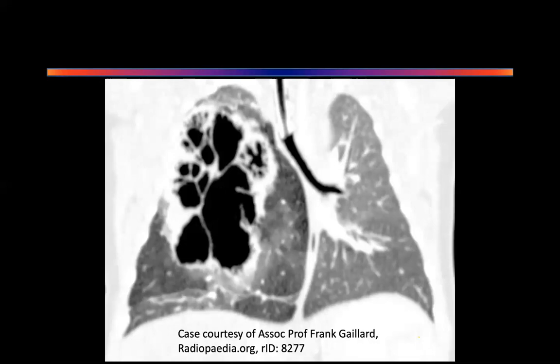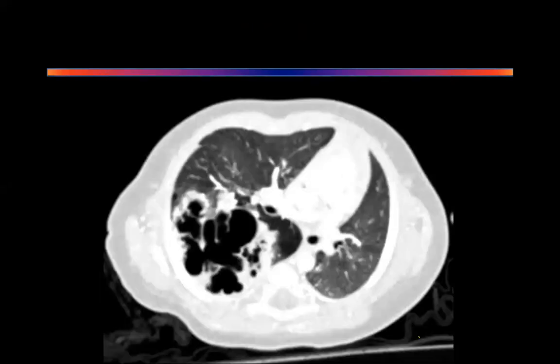Right. So this is a contrast CT scan. There are no descriptive markers on the CT scan, but it shows a multi-lobulated, septated lesion on the right side, causing mass effect and shift of the mediastinum to the left-hand side. Excellent. I'll show you another shot of this. Same CT scan, keep talking. It is a transverse section at the level of the heart, showing the lesion located in the posterior aspect of the right lung. It is again lobulated with septations and strands present in the cavity, causing mediastinal shift to the left-hand side. The most important thing is it's causing mediastinal shift. That's what I want you to tell me.